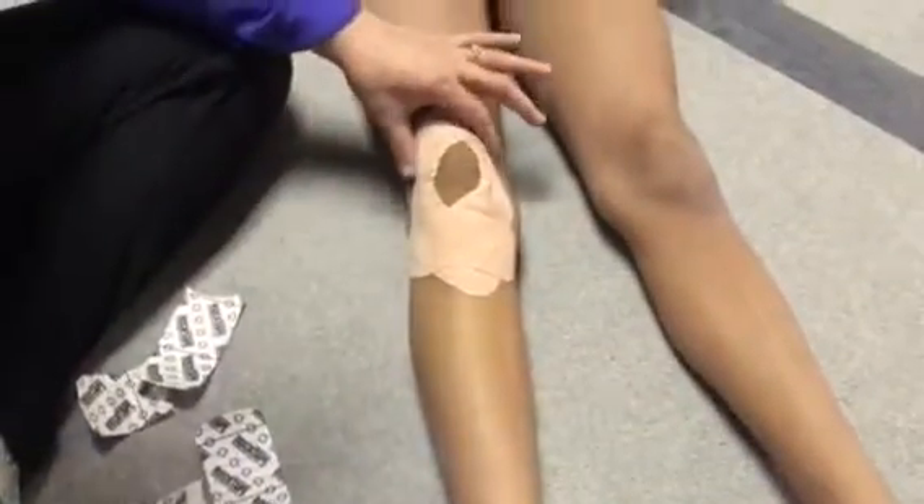When she straightens her knee, you can see how the skin is lifted up, and that's what helps her to have less pain when she's doing her gymnastics.